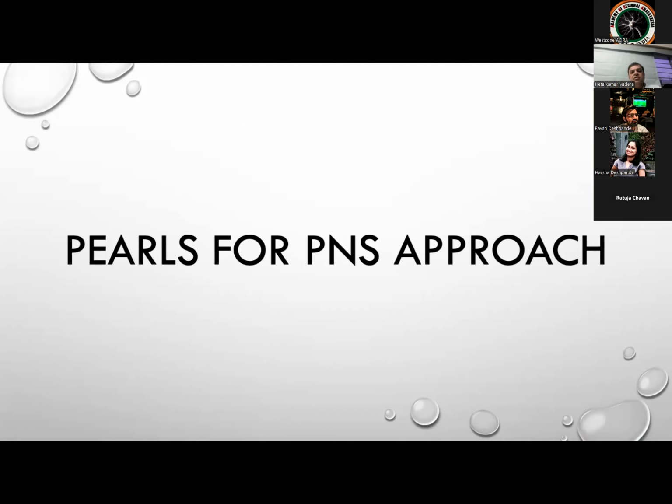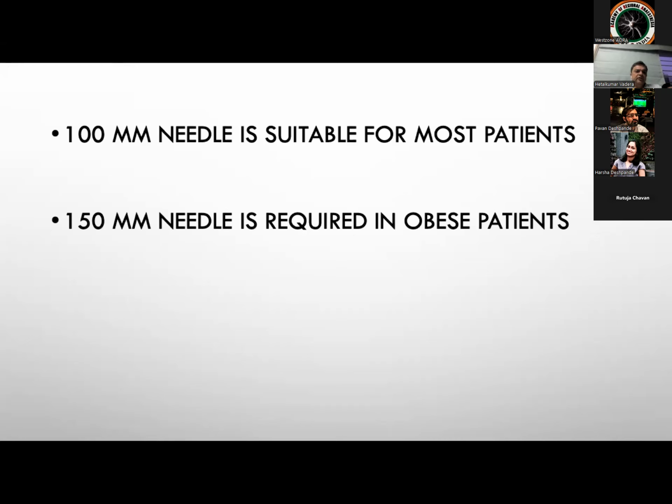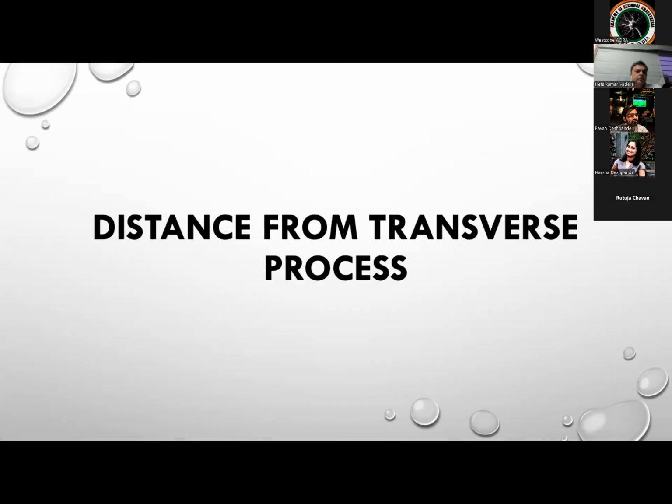are chances that the drug will spread in the epidural space, especially in Capdevila's approach. It can cause epidural spread, and there will be bilateral blocks. So, selection of needle: it is common to use 100 to 150 in obese patients.